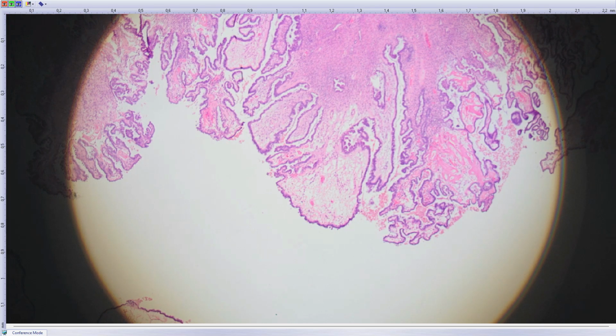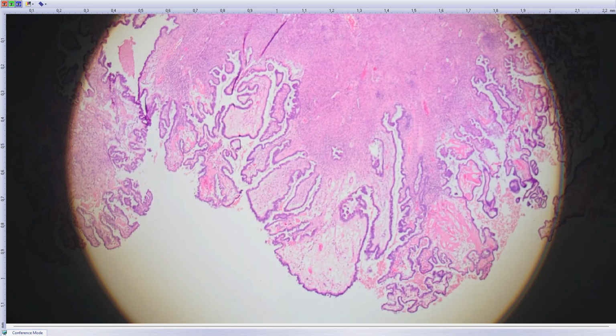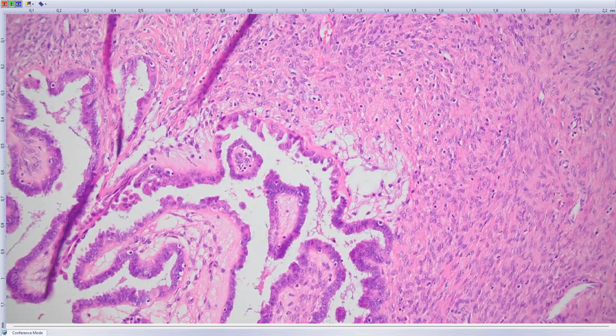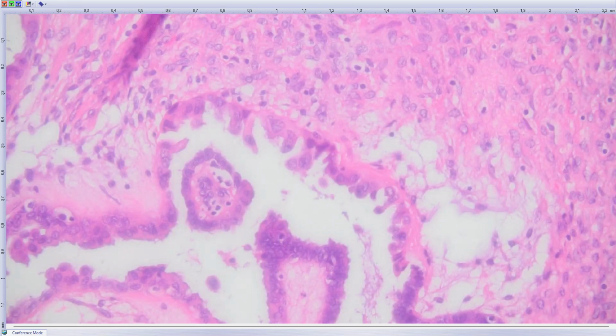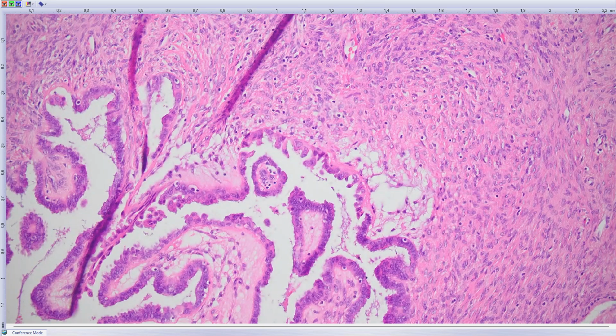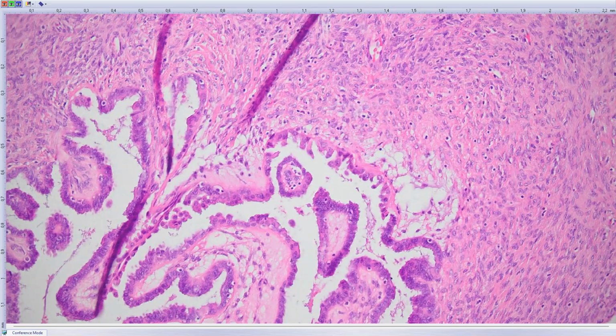If you look at higher magnification of these micropapillary cells cytologically, there are eosinophilic bleb-like cells in it. At very large magnification, there are eosinophilic cells. These are hobnail cells. These hobnail cells are typically senescent cells that do not divide, and all cases are BRAF mutated. These cells do not exist in any other tumor of the gynecological tract. It's rare to find them like that. I counted them as a part of Müllerian type cells.